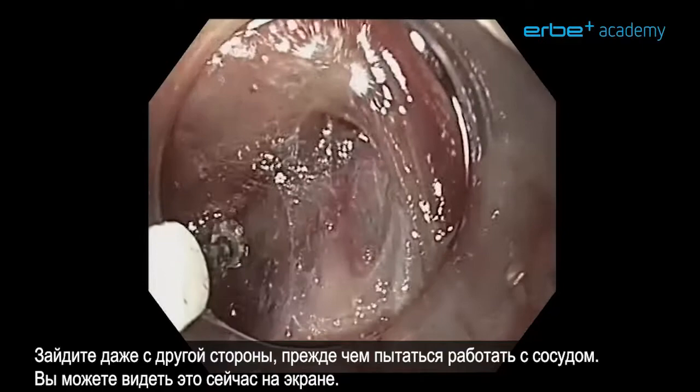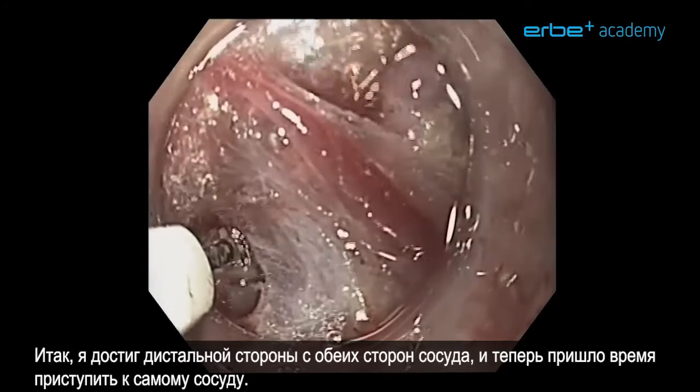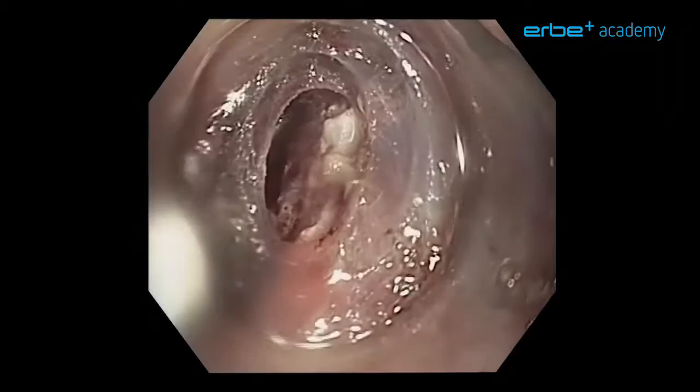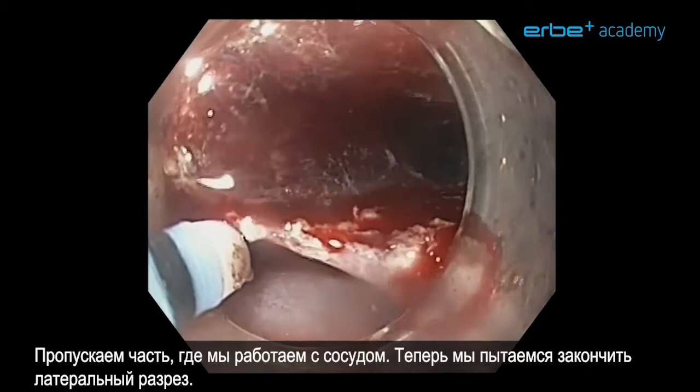We even open from the other side before we attempt treating the vessel — you can see that happening here. I've reached the distal side from both sides of the vessel and now it's time to treat the vessel. I skipped the part of treating the vessel, but now we try to finish the lateral cuts.